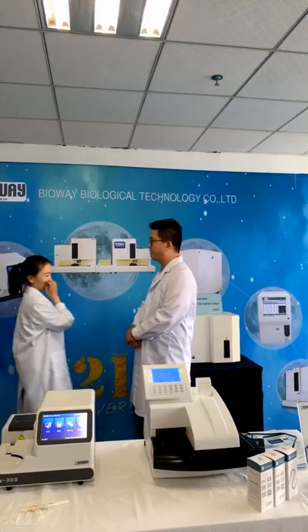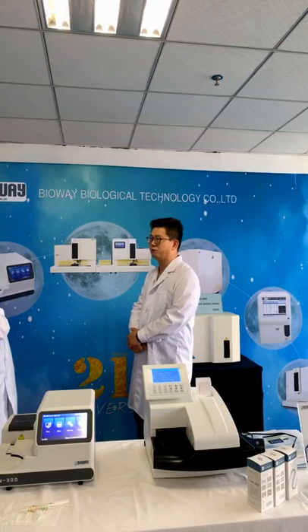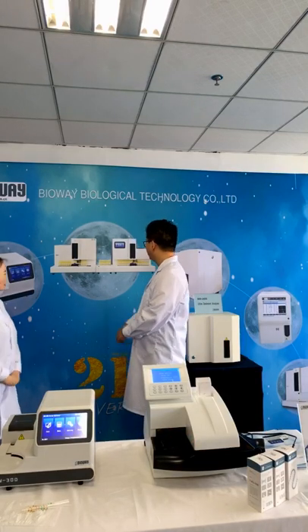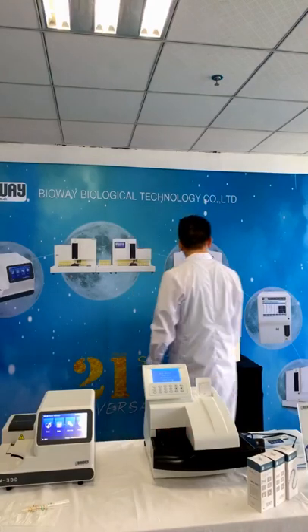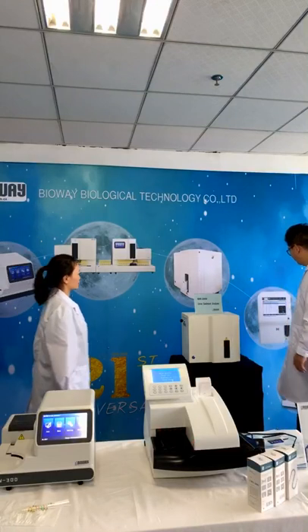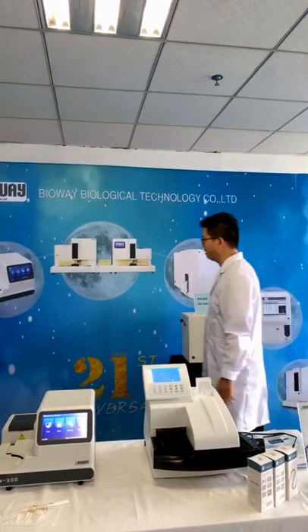The largest capacity of this is about what? Yeah, it's about 50 tubes, just like 5 racks of tubes, like the image display. This is 2,000, and this is 1,000. The 100 is not in the camera.